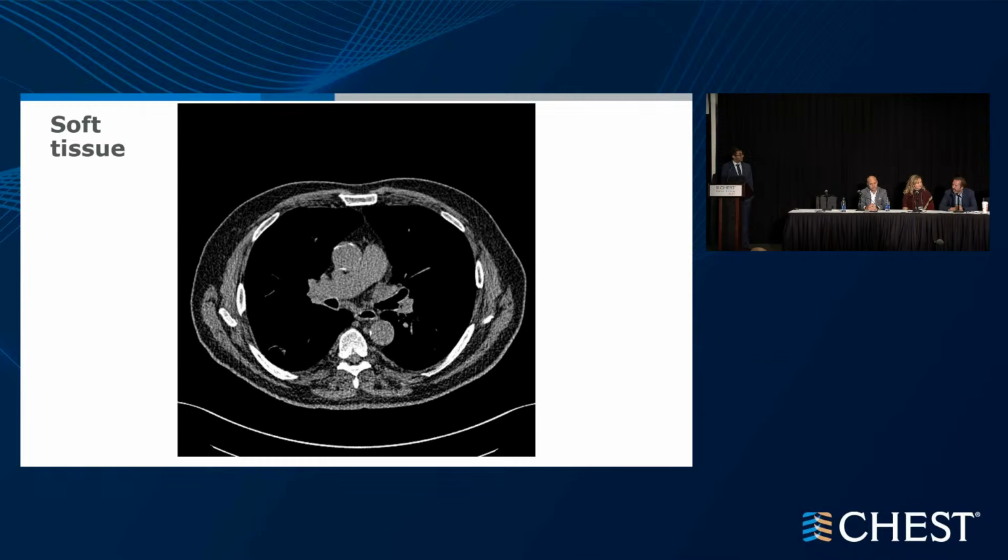More importantly, though, both of these lesions have indications, pretty strong indications in my mind, for a full staging EBUS survey. So the right lower lobe lesion is 4 centimeters. It's a mass. It's not a 1A lesion. And so anything over 3 centimeters has, I think, fairly good data that deserves full mediastinal staging. So that alone buys this patient a bronchoscopy. And while you're at it, you can go after these other things.